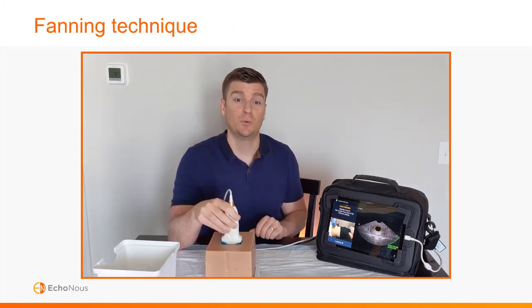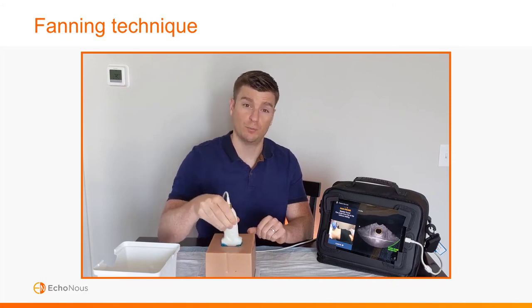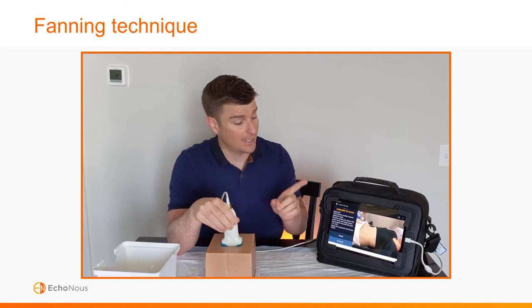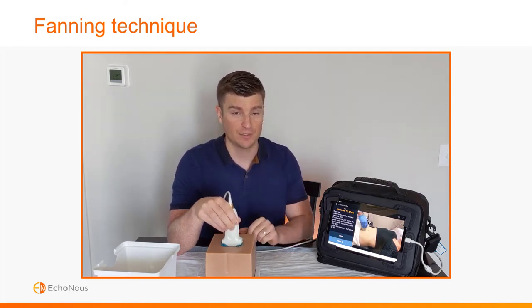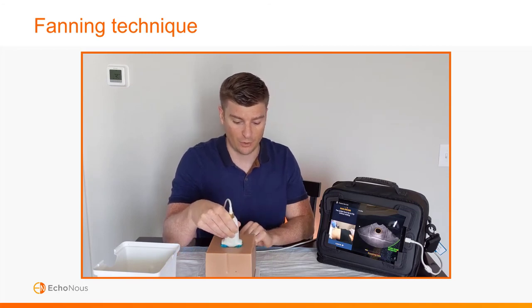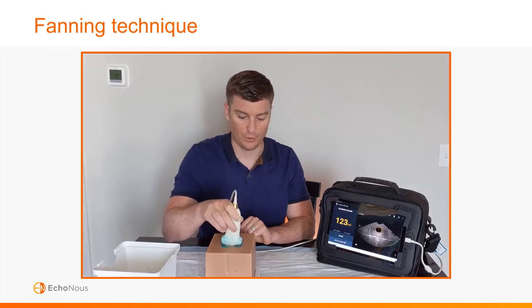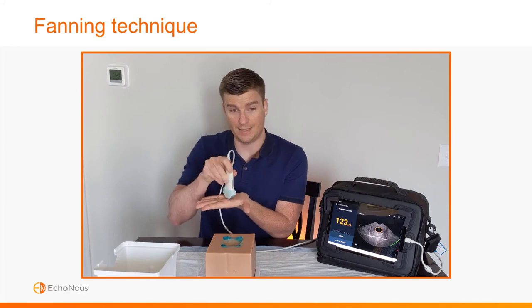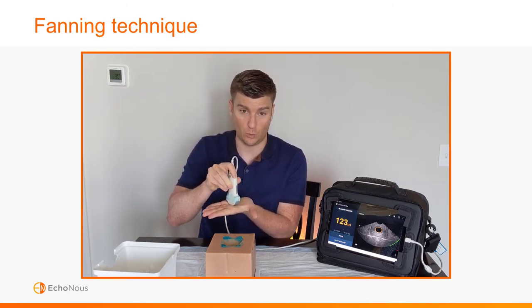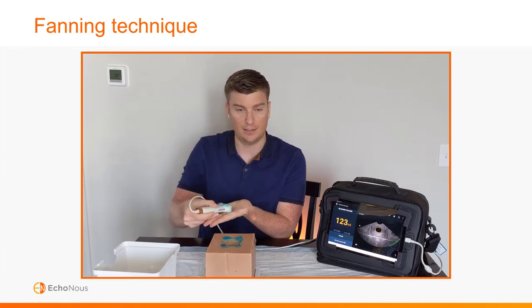Now that we know how to get a good image, let's perfect the fanning technique. The first thing is how you hold the probe — instead of fully gripping it, hold it more like a pencil, which allows a larger range of motion for fanning. When you're fanning, watch your hands, not the screen — this prevents sliding. A normal fan involves finding the bladder, then fanning all the way to one side until it dings, then fanning to the other direction. Where people go wrong is sliding the probe instead of staying in one spot, which smears the image. Make sure you fan from hip to hip in one spot — a lateral movement side to side — without any U-shaped or twisting motion.